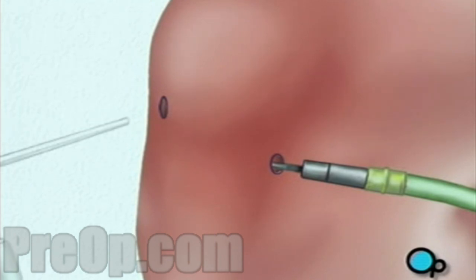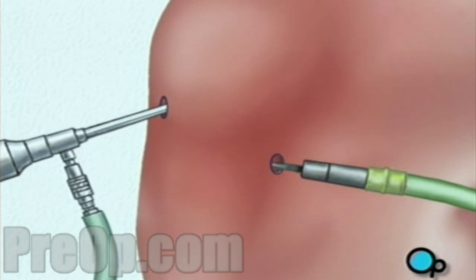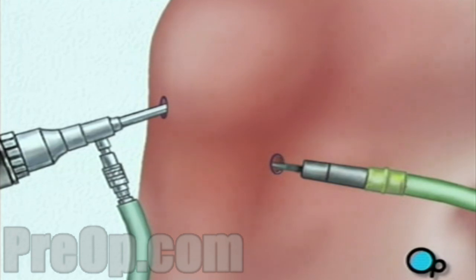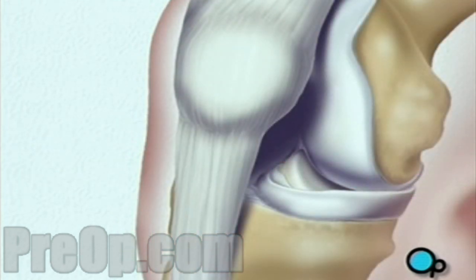The actual surgical instruments will be inserted through one or more other small openings. After verifying that the anterior cruciate ligament, or ACL, has been severed, your doctor will begin the procedure by removing a piece of tissue from the front of the knee.